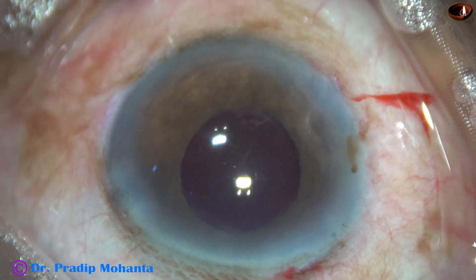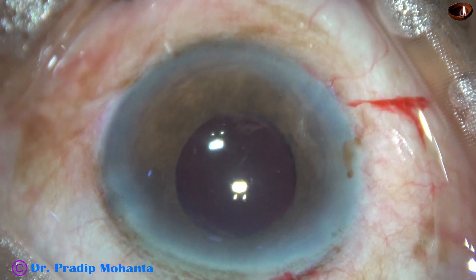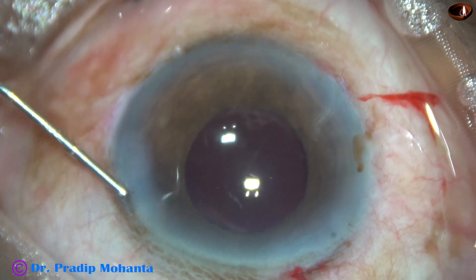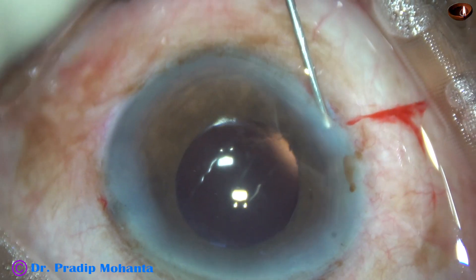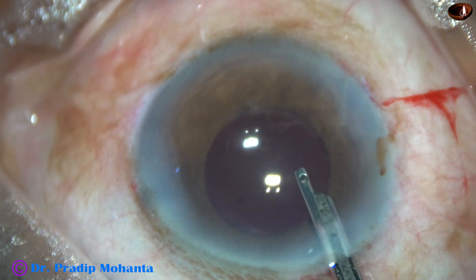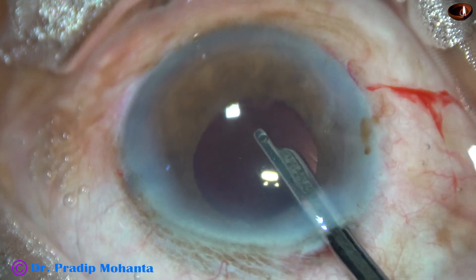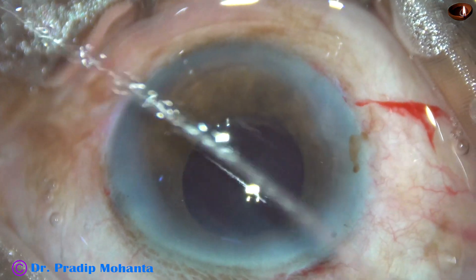After thorough cleaning of the visco, this is a bit of moxifloxacin. The side ports are closed by hydrating corneal stroma with balanced salt solution. A final lavage is carried out by this 23-gauge Simcoe cannula. The anterior chamber is nicely formed in this way, and the case is concluded.